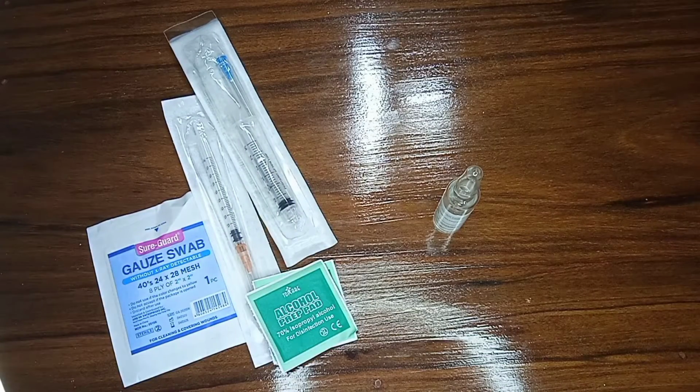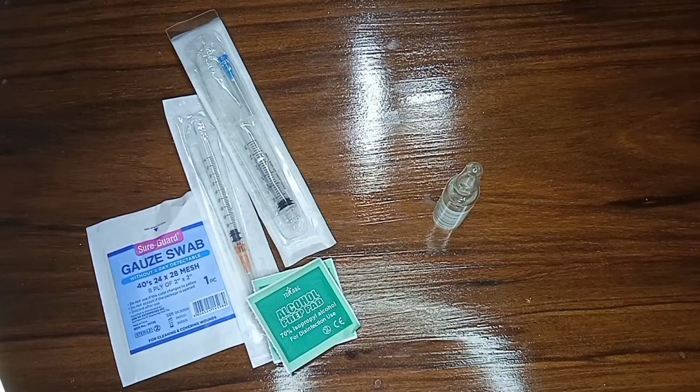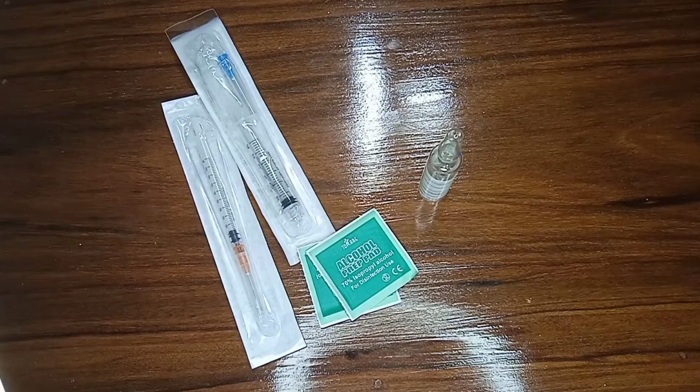So first, we are going to perform a hand hygiene. It's either to wash our hands or to sanitize them. Then, we are going to prepare the drug or the ampule for drug withdrawal. Next, we are going to flick the upper stem of the ampule several times with a fingernail. Then, we are going to place a piece of sterile gauze between our thumb and the ampule neck. But first, we are going to clean the neck of the ampule using the alcohol prep pad.